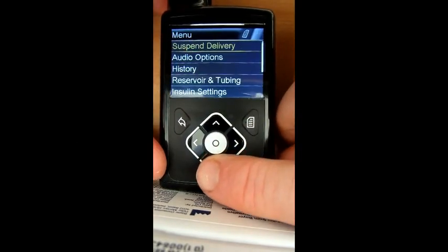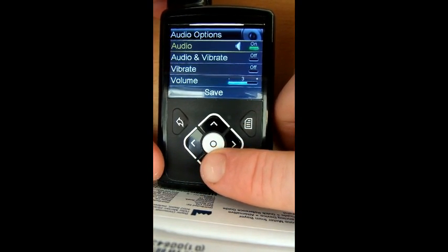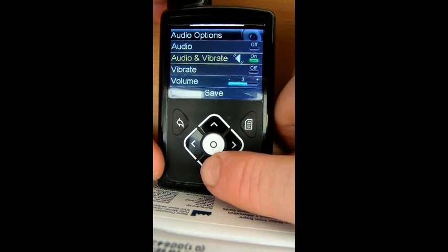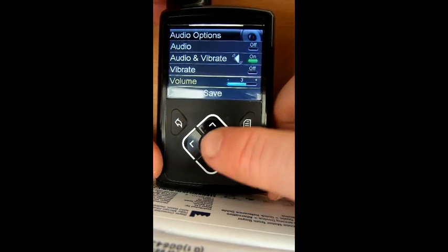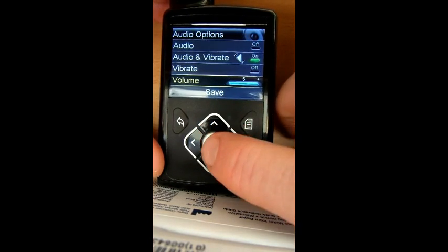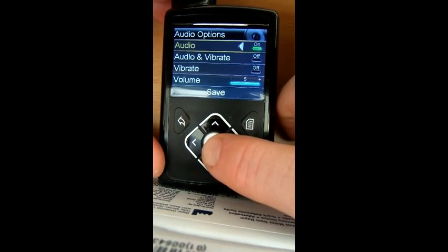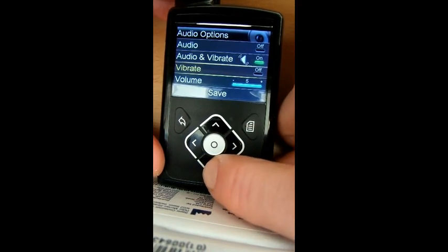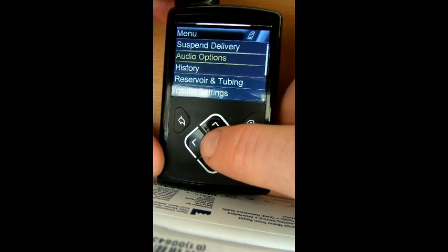One of the new things is the alerts — audio options. You can now have audio, audio and vibrate, or just vibrate, and you can change the volume. For me, audio and vibrate, because sometimes I don't have it next to my body and sometimes I can't hear it. You can now turn the volume up to five. That's quite a bit louder — a good bit louder than before.